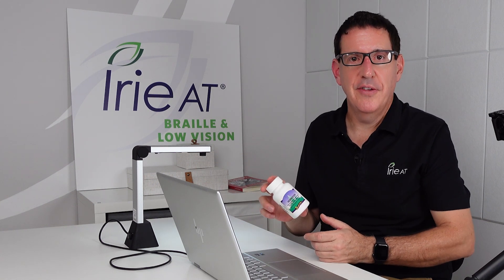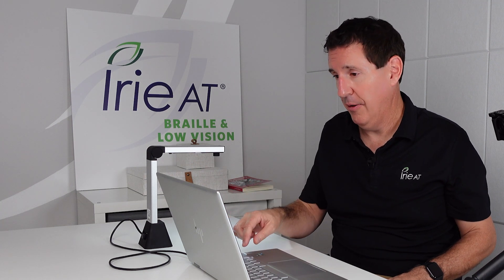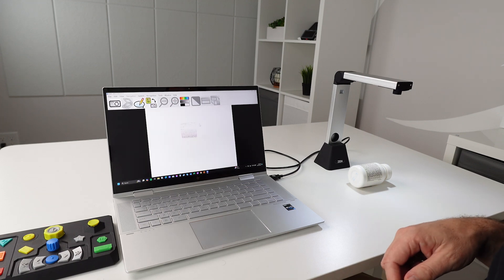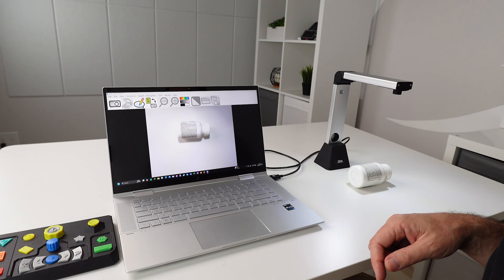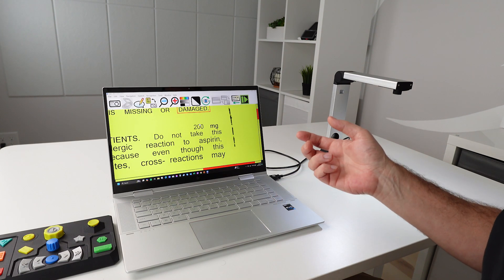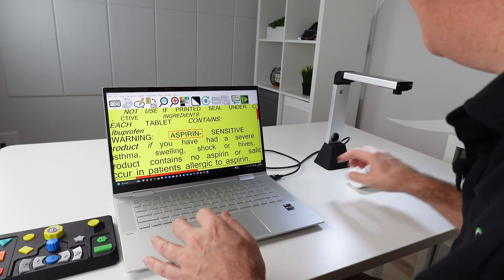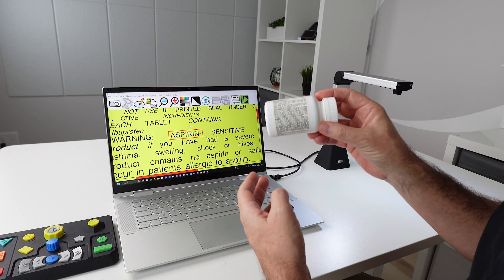I promised we'd give this a real test. I've got the Zen camera here and a pill bottle — there's no way I'm ever going to read this tiny text in my whole life. I need to put this underneath and see. Now, this is way less than a six-point font — I don't think it's even a two-point — but let's see what it can do. Capturing. Recognizing. 'Not used if printed seal under cap is missing or damaged. Ingredients. Each tablet contains.' That's amazing — it scanned this on a curved surface. When they say it's accurate, they're right.